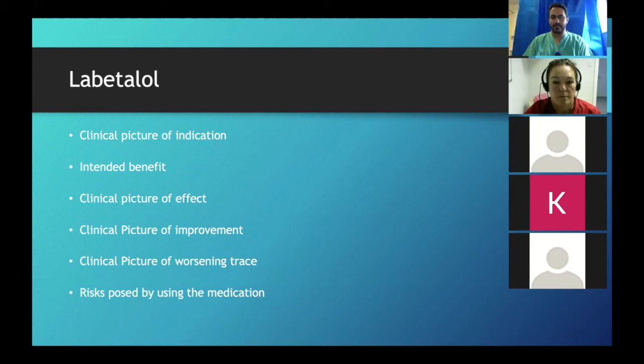It blocks the entire sympathetic system. So the baseline will go down, but why? Because the sympathetic nervous system isn't working as well, so the parasympathetic pulls it down. Yes. So the parasympathetic is going to pull it down. Correct. Okay. What about variability?